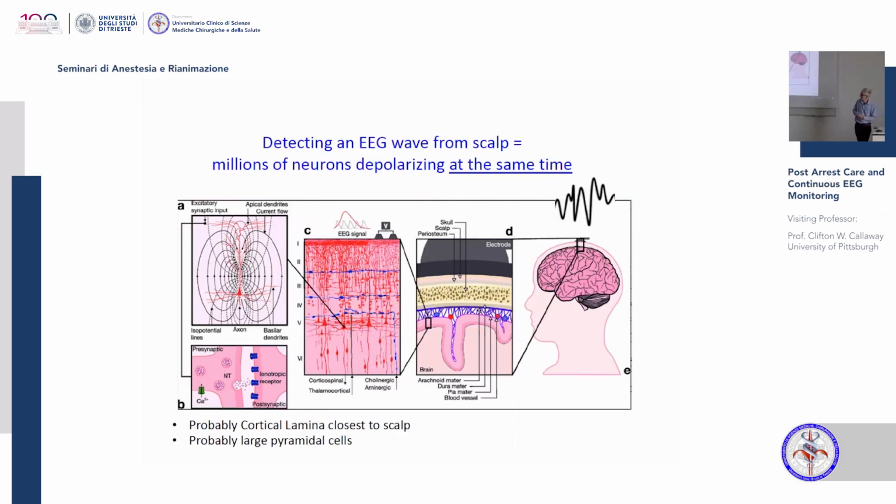It's also very important to understand how limited EEG is. Like this graphic I took from a research group, their paper on making interfaces between computers and brain. I don't know if their goal is to make better video games or to help people who are paralyzed, but this is their research. They made a very nice graphic reminding us how much neuronal activity is required to be able to detect it with wires on your scalp.